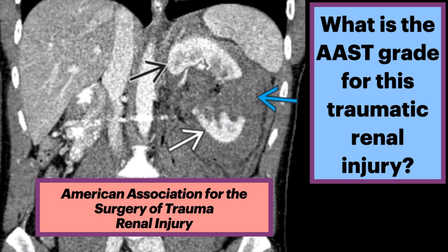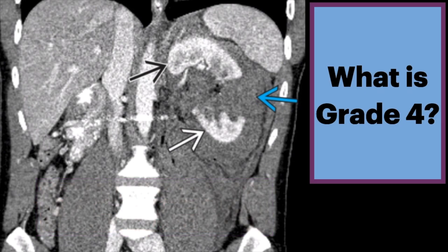Let's review the renal injury grading from the American Association for the Surgery of Trauma. Coronal CT during the nephrographic phase following a gunshot wound to the left flank shows fracture of the left kidney. The superior and inferior fragments are perfused but separated and surrounded by intermediate attenuation fluid. This is a grade 4 injury.